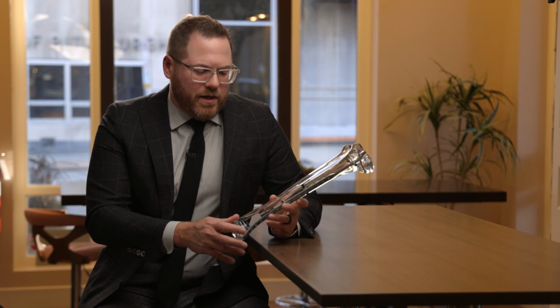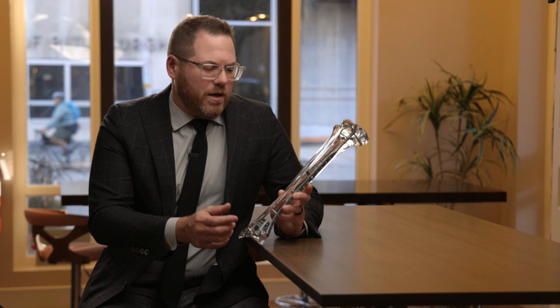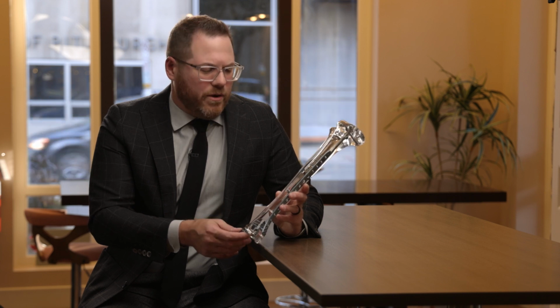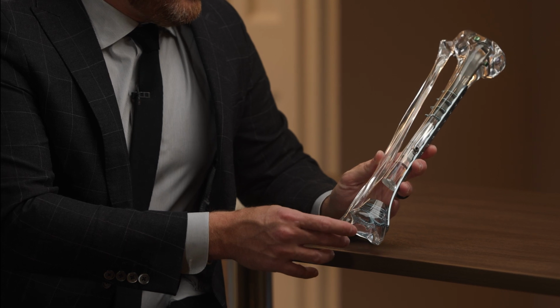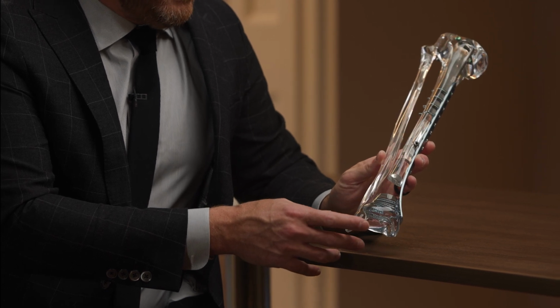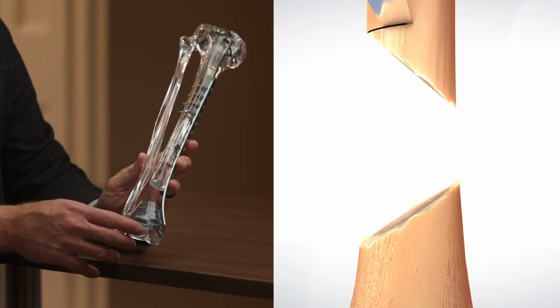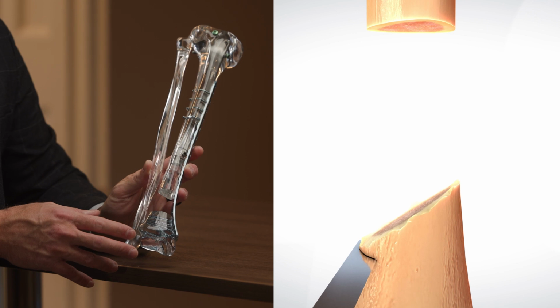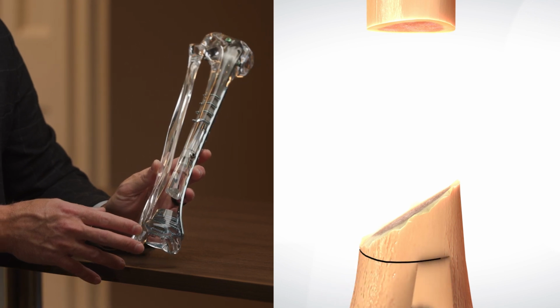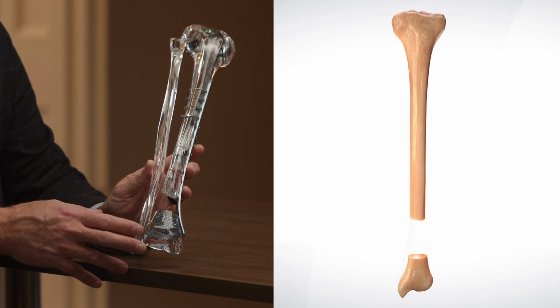Briefly, the technique for the plate-assisted bone transport involves a plate as well as the Precise intramedullary nail. Here's a model of the tibia and fibula. The sequence of steps would be, as you can see here, we've, in this model, assessed the bone defect and performed the appropriate debridement or resection, creating our space and preparing the docking segment.